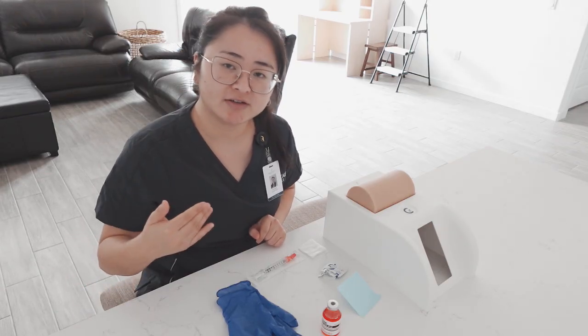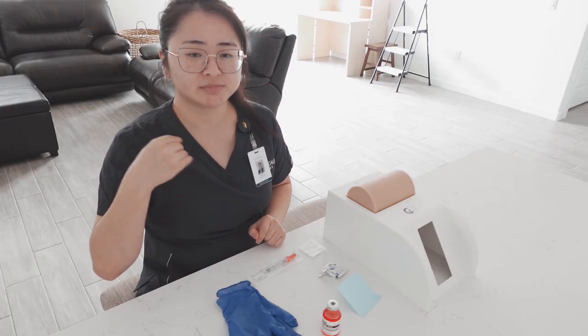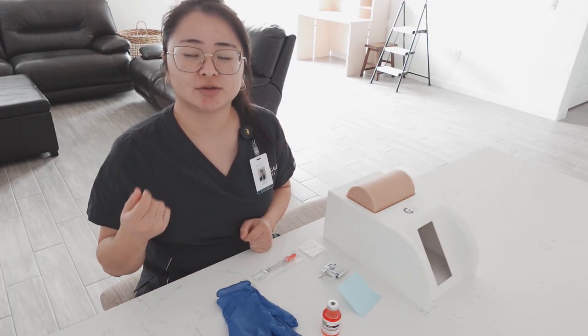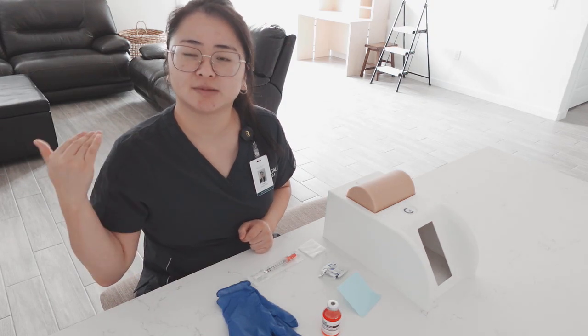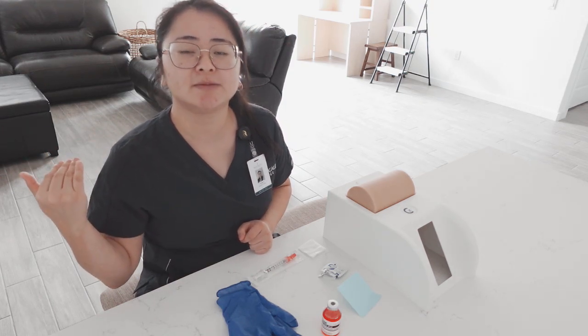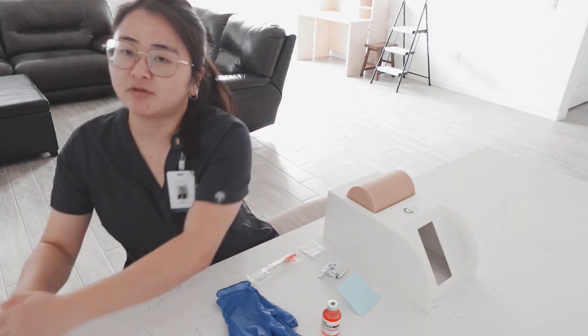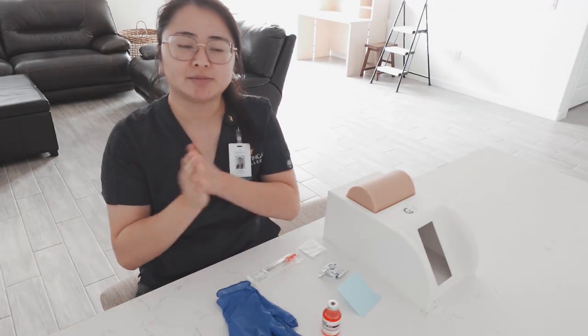Now that I've verified everything, I'm going to take all my supplies, go to my patient's door, knock on my patient's door, enter the room, close my patient's door, close my patient's curtain to ensure patient privacy. I'm going to put my supplies down on a flat, dry, clean surface. I'm going to perform hand hygiene and introduce myself to my patient.